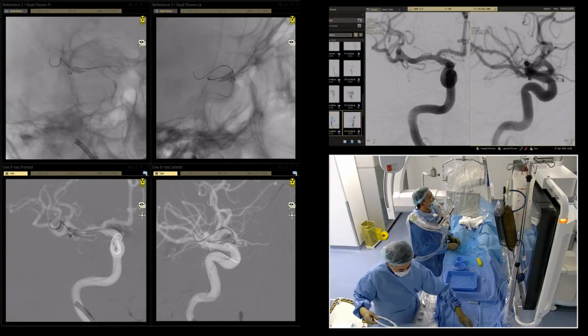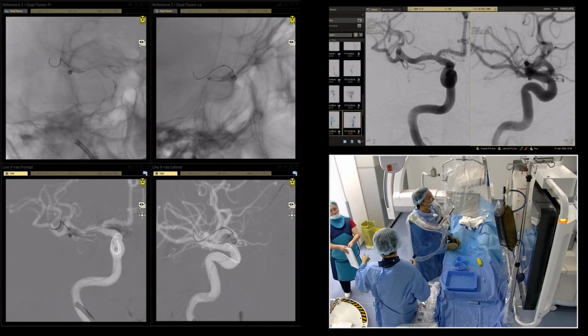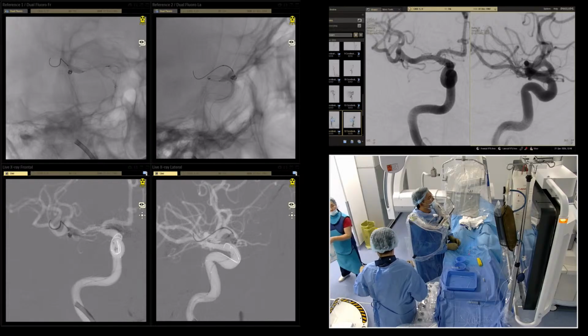It's a 2x4 optimal. And next coil, I asked to give the optimal 1.5.